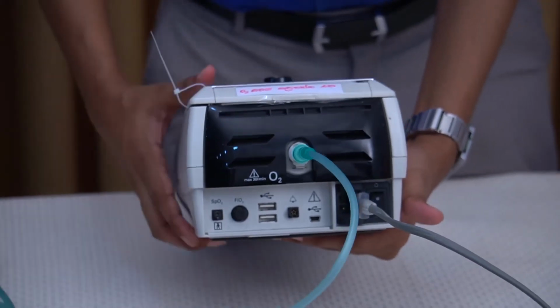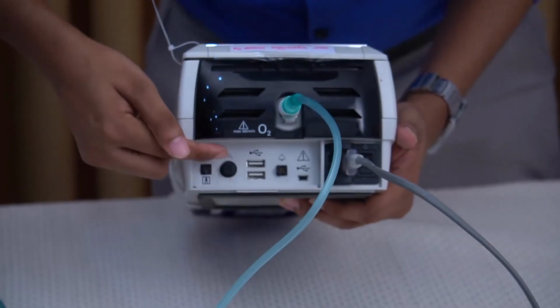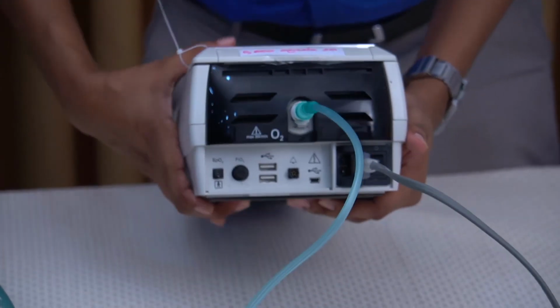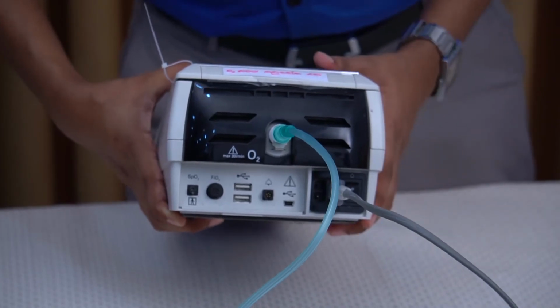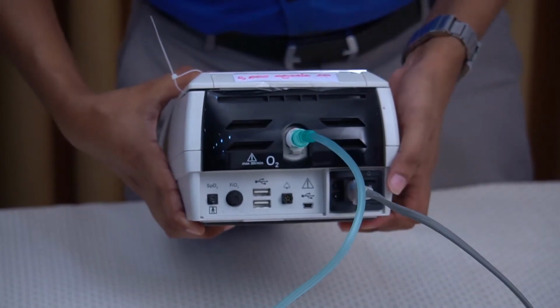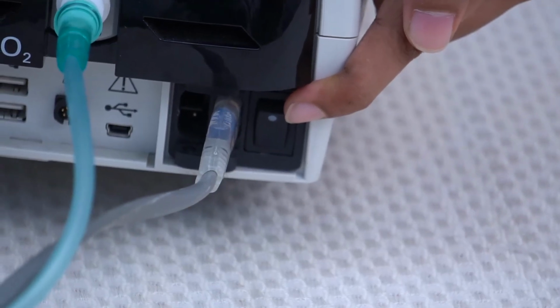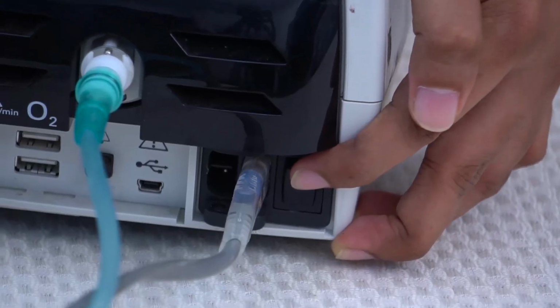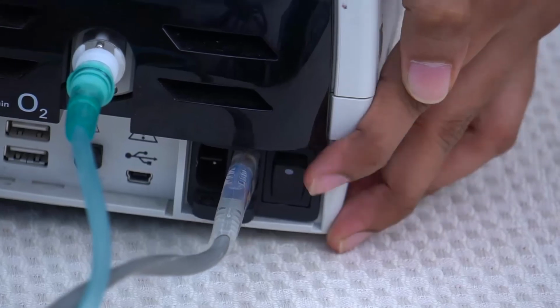Second one, USB port. Third, pulse oximeter connection port. Fourth one, main on and off switch. This small switch here is used to turn the unit on and off. This switch does not have an on and off position. It appears the same in both positions. Once you press the switch, it will change from on to off or off to on.